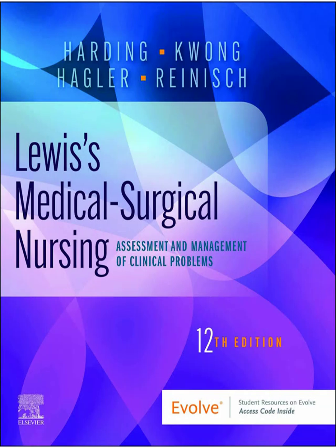You got it. And the big safety alert. Shout it from the rooftops. OFF for defibrillation, on for cardioversion. Always. And never put those pads directly over an implanted pacemaker or ICD. And always, always shout all clear and make sure everyone is physically clear of the patient and the bed before you push that shock button. Non-negotiable safety for you and the team.